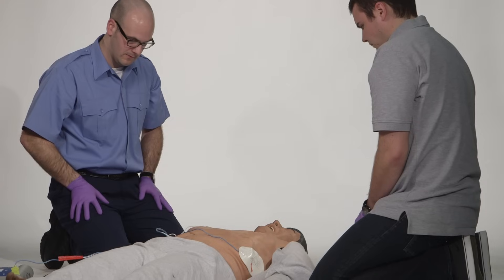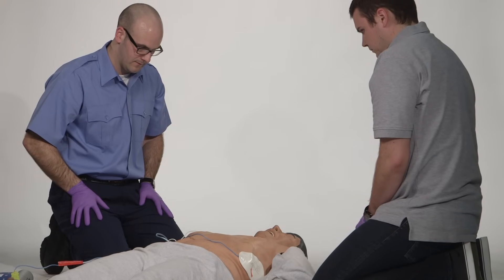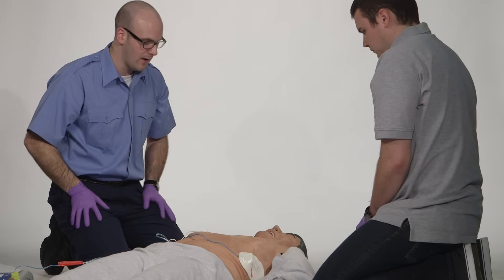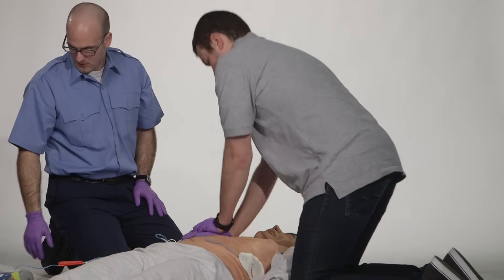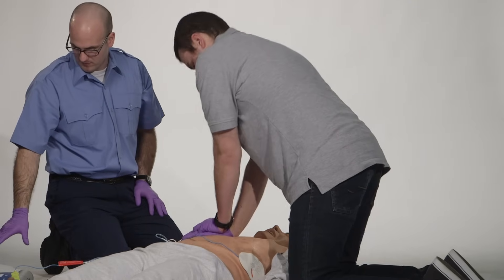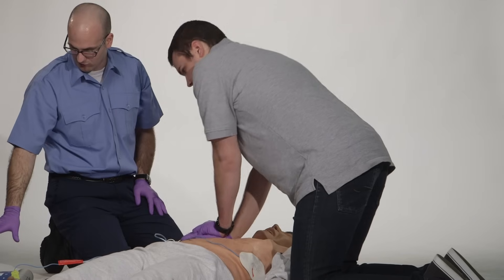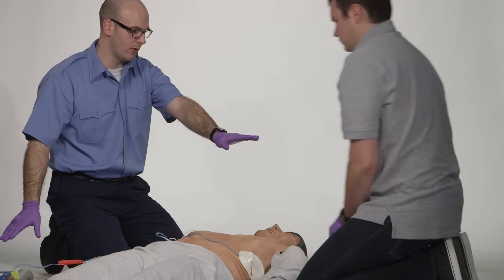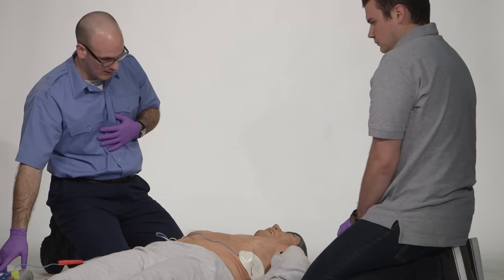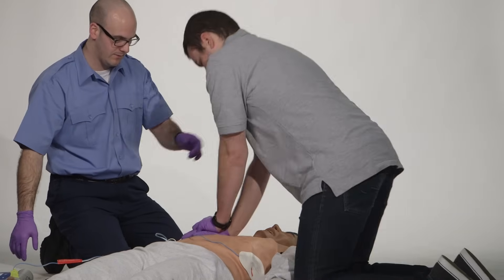I'm clear. You're clear. Continue CPR, please. AED is charging up. AED is properly charged. You're clear. I'm clear. Shocking. Shock delivered. Continue CPR.